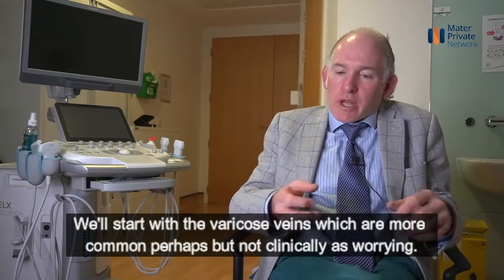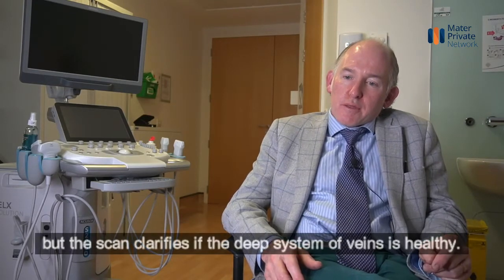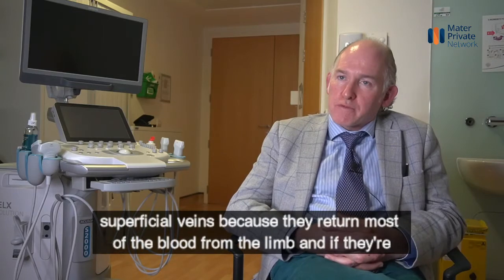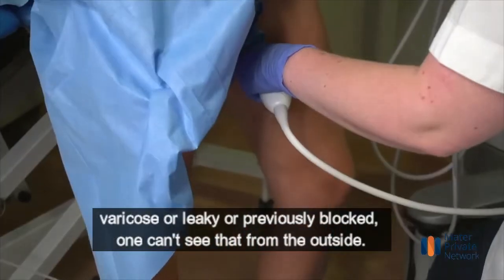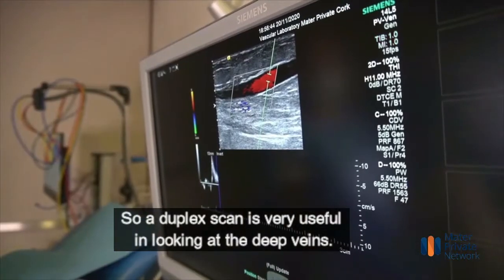With regard to, we'll start with the varicose veins, I suppose, which are more common perhaps, but not clinically as worrying. A patient and the doctors will usually see the varicose veins, but the scan clarifies if the deep system of veins is healthy. The deep system of veins is more important than the superficial veins because they return most of the blood from the limb. And if they're varicose or leaky or previously blocked, one can't see that from the outside. So a duplex scan is very useful in looking at the deep veins.